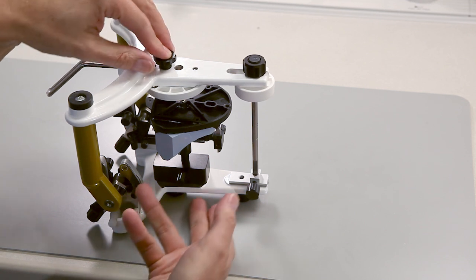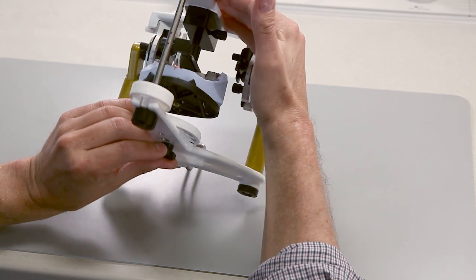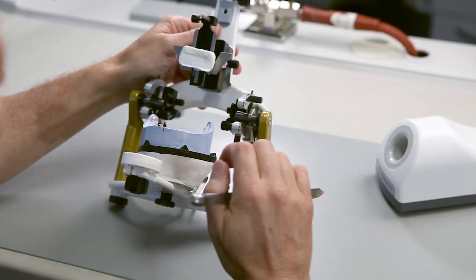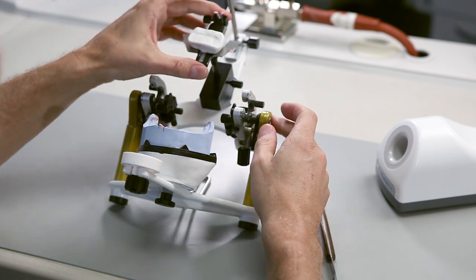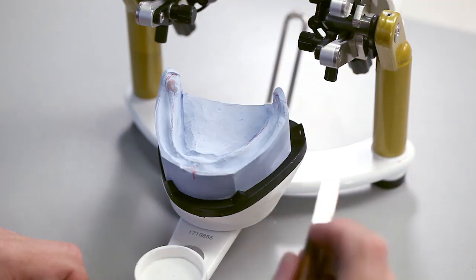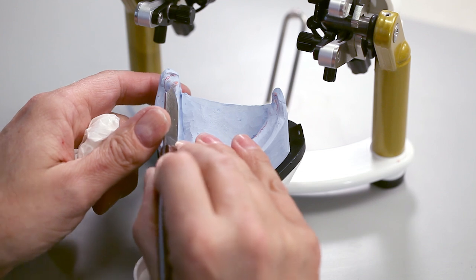Articulate the models in the usual way, with or without a split cast system. Once the plaster has set, you can carefully detach the horizontal guide from the mandibular model and remove the instrument carrier. Also remove any interfering residues of sticky wax without damaging the model.